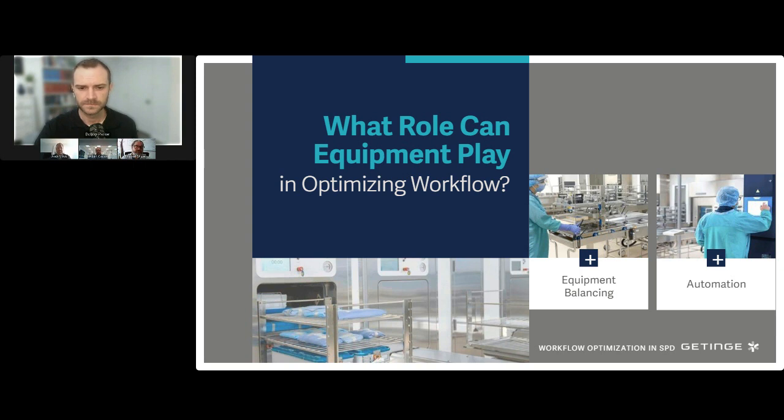It's not just process, but it's also what can you add automation-wise, by some form of automated conveyor and automatic load, unload for sterilizers, et cetera, based on what's available and what your department can support, not only financially but structurally and space-wise. But you want to keep in mind what's important for your personnel, what's going to keep your personnel happy as well.